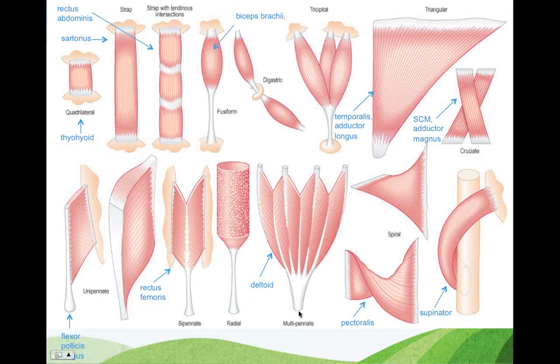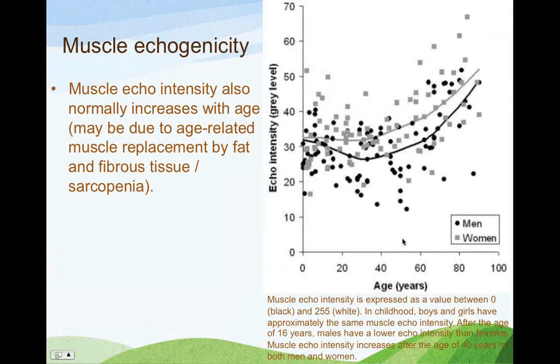And then here in the deltoid, you can see it's multipennate. So it doesn't have just the one fascial layer in the center. It has 1, 2, 3, 4, 5 going through. So it almost has a flower petal-like appearance when you make a slice through it. So that's just important to keep in mind when I start showing you these photos.